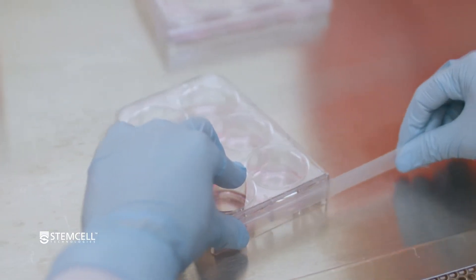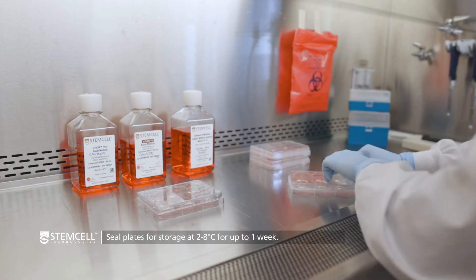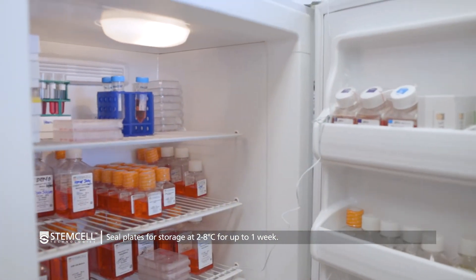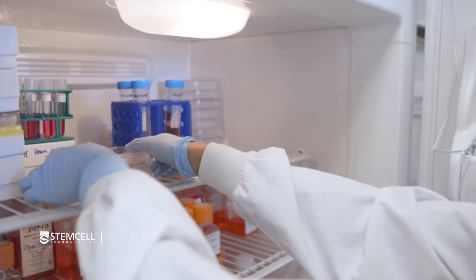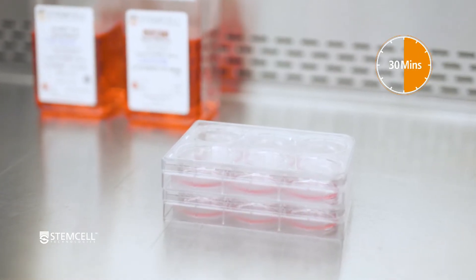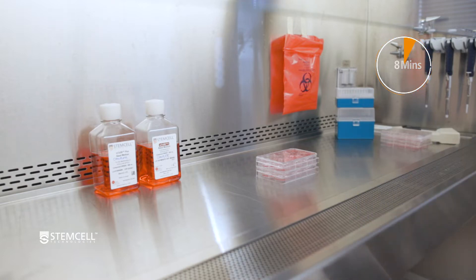If the coated plates are not needed immediately, they can be sealed using parafilm and stored for up to 1 week at 2–8 degrees Celsius. When the stored plates are required, allow them to come to room temperature for 30 minutes prior to proceeding and ensure that the Matrigel has not evaporated.